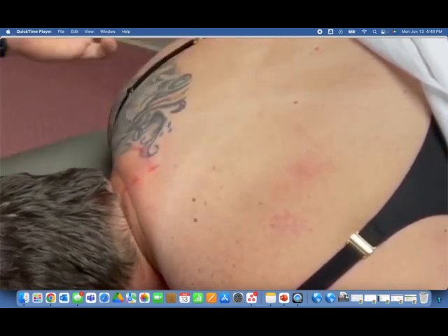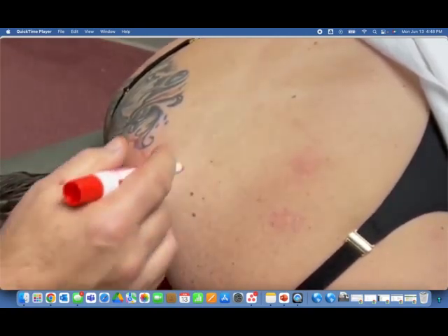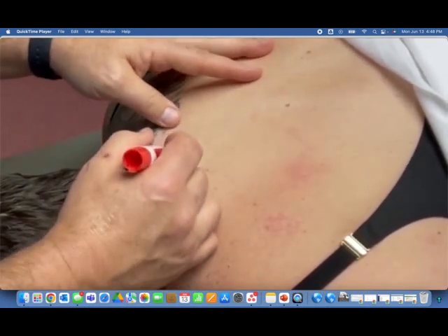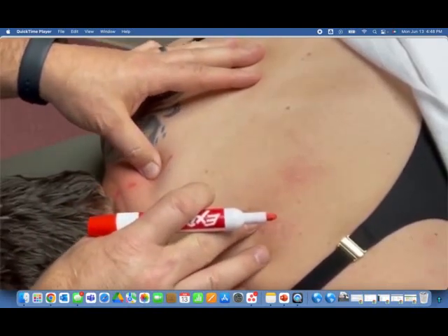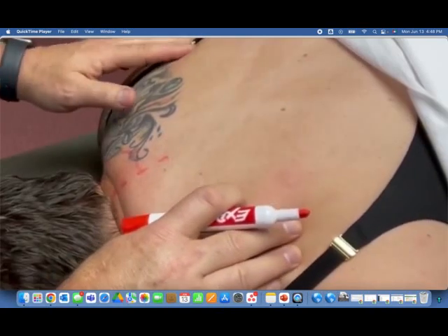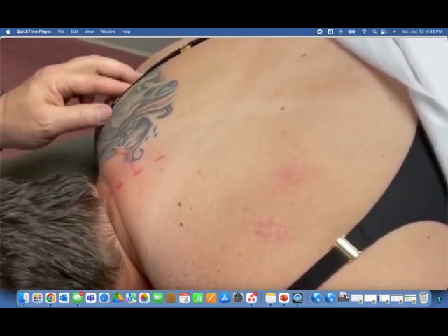So here's T1. We talked earlier about the sternal notch. Its posterior border would be T2. So I know we're sitting here at T1 because we did our rotation. It didn't move. That would make this T2. But I'm interested in T4 for our purposes, for the dry needling we'll do here.